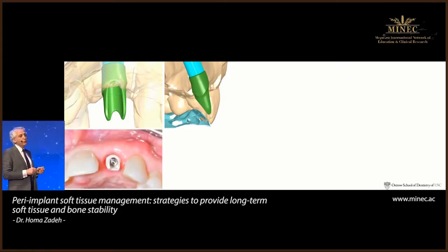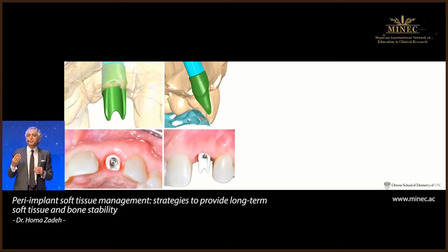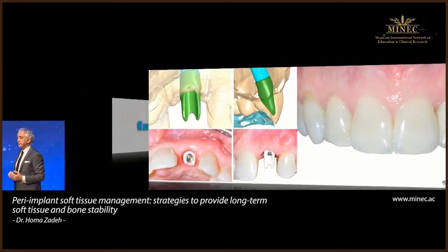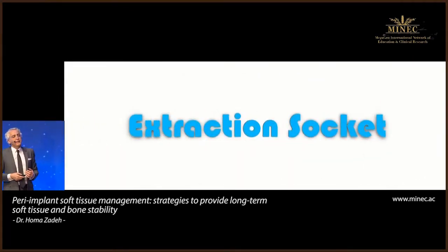And then you have very little restorative contour on the facial to try not to push the tissue out. I've done similar cases where the patient goes back to the restorative dentist and they put a big bulky abutment on it and push the tissue back up. So you have to make sure that we keep things to the palatal, the implant as well as the restorative and abutment.